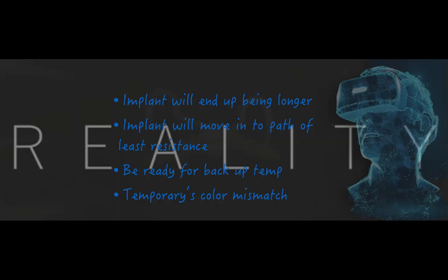Okay, the implant will move into the path of least resistance. That's why every step of the way, I try to go ahead and put a special paralleling pin in, and even if I'm not doing computer guided, I will try to go ahead and put some sort of guide to allow me to verify each osteotomy after the osteotomy is done. 2 millimeter, 2.5, 3. So I can put a paralleling pin. If your implant system doesn't have a paralleling pin, use the burr that you just used.